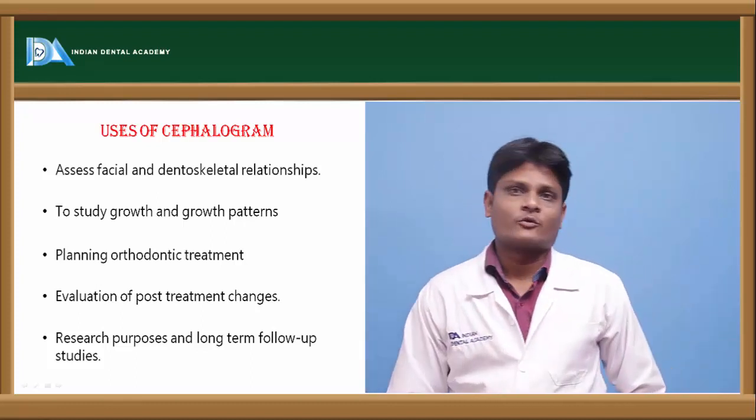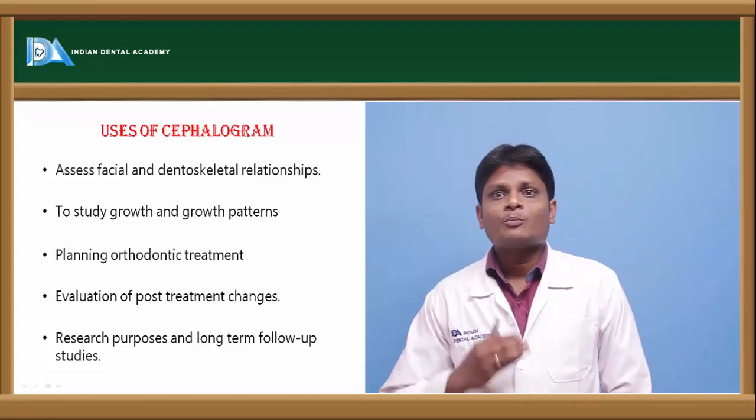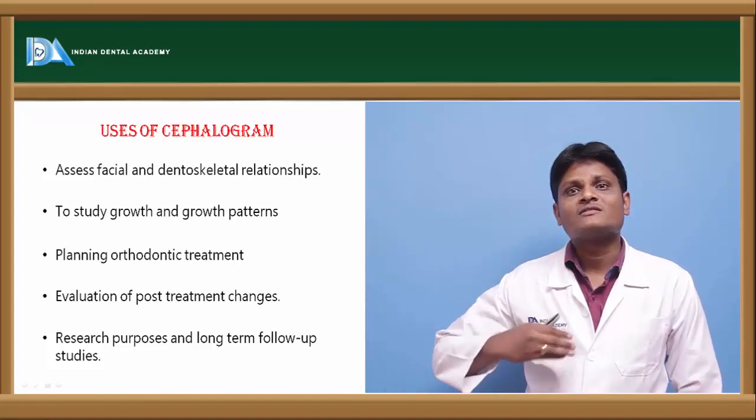The next important use of lateral cephalogram is to plan the orthodontic treatment. So there is something called the visualized treatment objective.